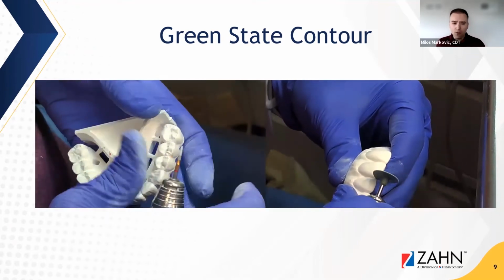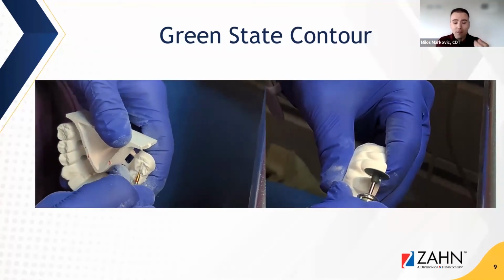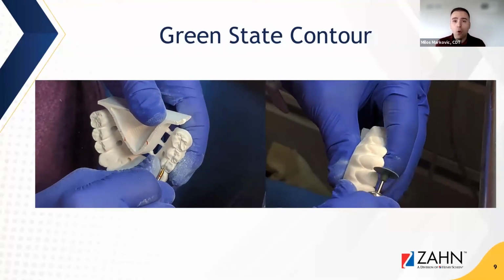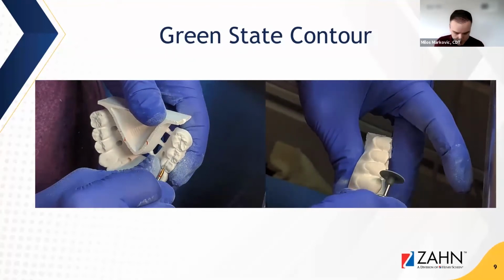And here you can see we also keep the sintering stabilizer on, obviously, which acts as a stabilizer for warping, but also acts as a handy tool for the ceramist or whoever's working on it to hold it while they're contouring it. So the benefits overall.